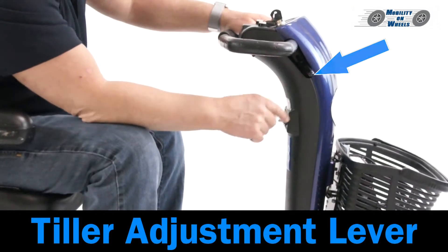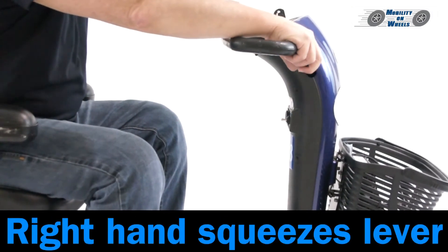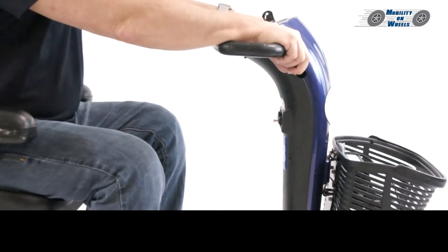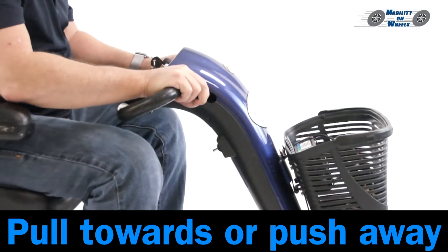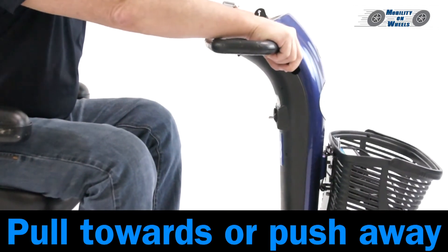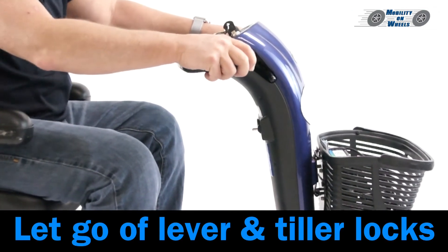Tiller adjustment. Use the tiller adjustment lever — your right hand squeezes the lever. Pull towards you or push away to adjust the tiller angle. Let go of the lever and the tiller locks in place.